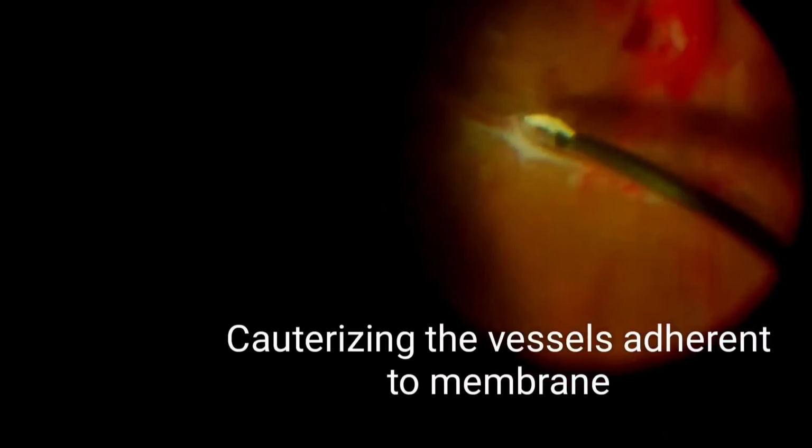The membrane edge was lifted using forceps without causing undue traction on the retina. The bleeding stalk over the disc was cauterized, and the bleeding vessel adherent to the membrane was also cauterized before dissection. Then we did one-hand scissor dissection of the membrane.